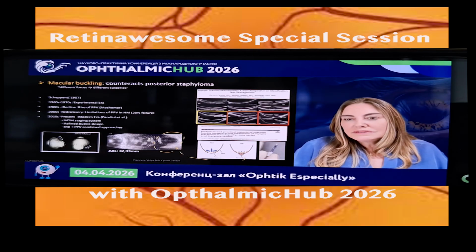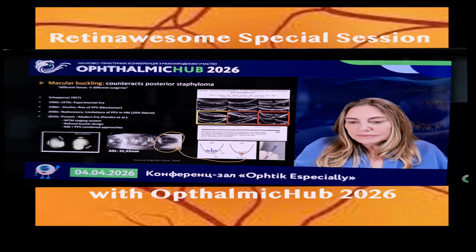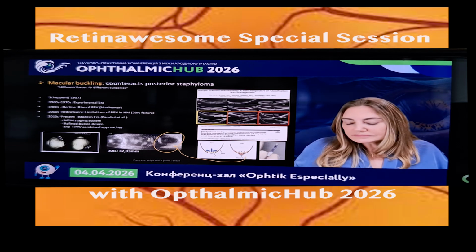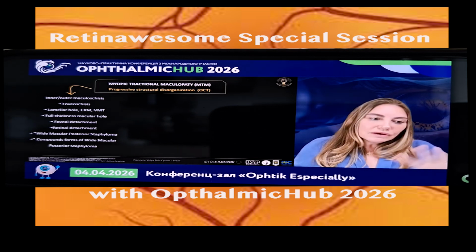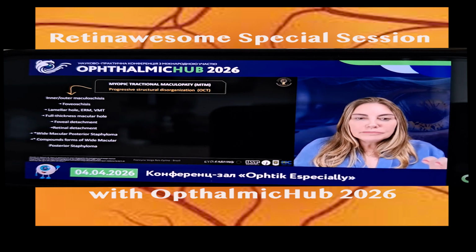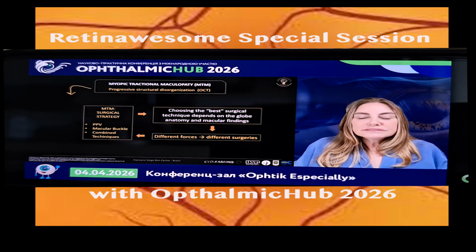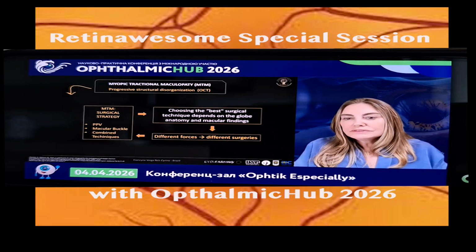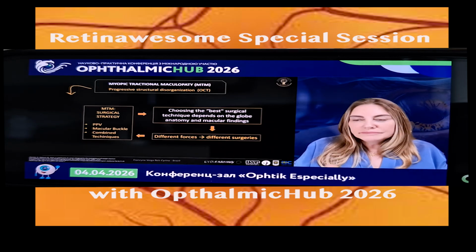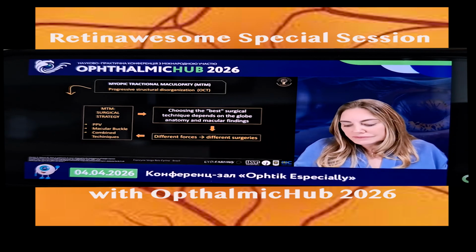As we can see here, the proposal is which one would be better: only macular buckling or macular buckle plus vitrectomy. We also published our insights and our experience in Brazil. Because of all these complications, I think we have to consider the surgical strategy based on anatomy, because choosing the best surgical technique depends on the globe anatomy and the macular findings. If you have different forces, you have to think about different surgery.